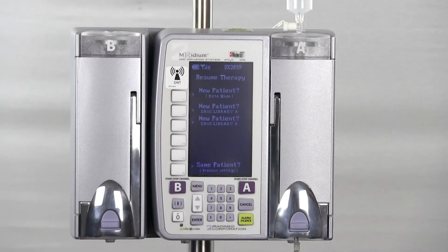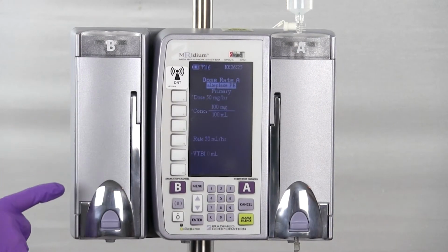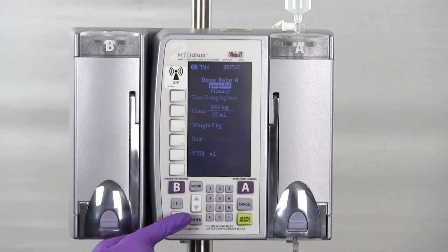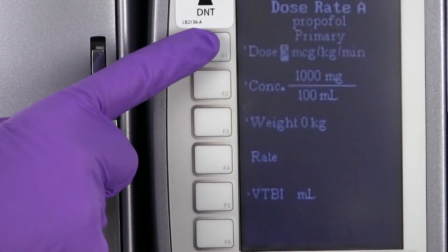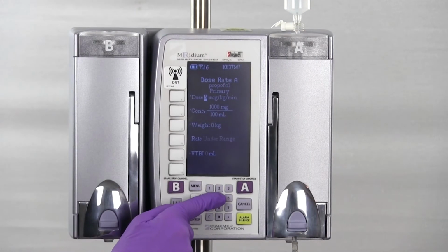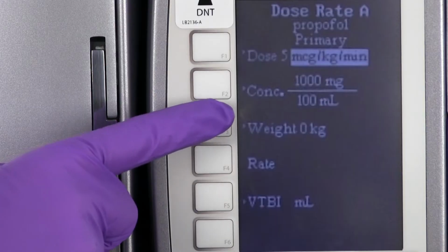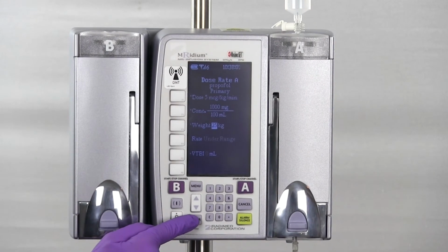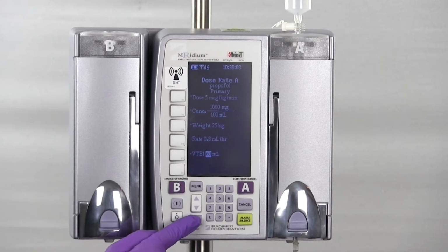To access the DERS drug library, the user will press the soft key adjacent to New Patient Drug Library A on the pump's initial screen. Using the up and down arrow buttons, the user will search for the drug propofol and press Enter. The user will then press the soft key adjacent to Dose. Using the numeric keypad, the user will key in the dose and press Enter. Next, the user will press the soft key adjacent to Weight, key in the weight of the patient, and press Enter. Finally, the user will key in the volume to be infused and press the Enter button.